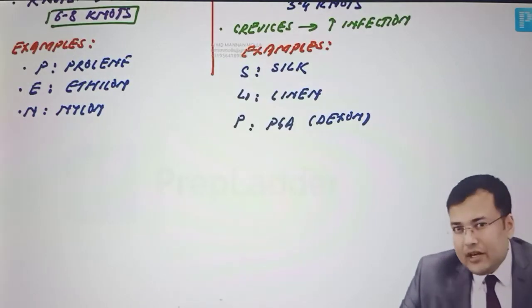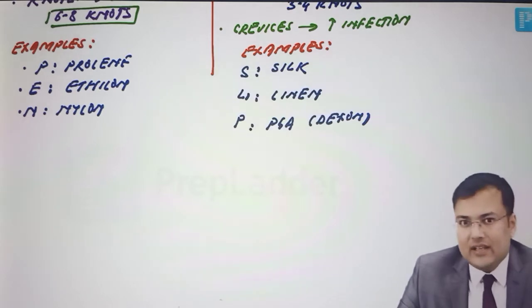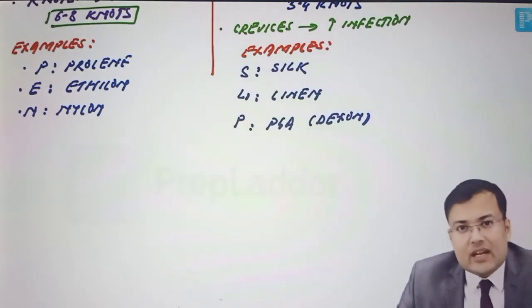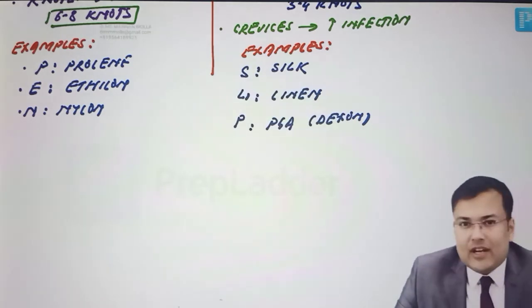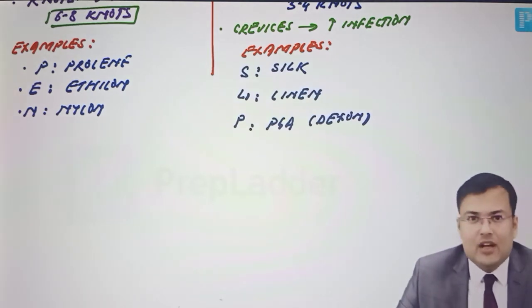Now if you have seen the trend or pattern of questions from the last 5 years in AIIMS, NEET, and INI-CET, you have noticed that almost every year there is a minimum of one question from sutures. And what kind of questions are asked nowadays? These are image-based questions. Generally, they give the image of a suture or the image of a packet of suture. And what is the good thing about the packet of suture? That the suture name is already written on the packet. So it's very easy to identify. So one by one we are going to discuss.